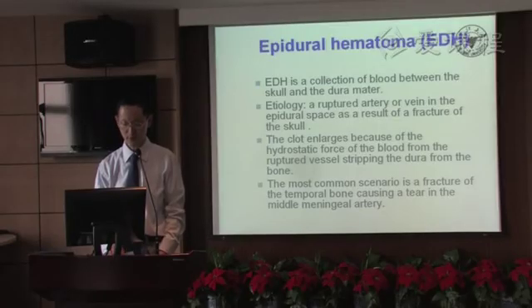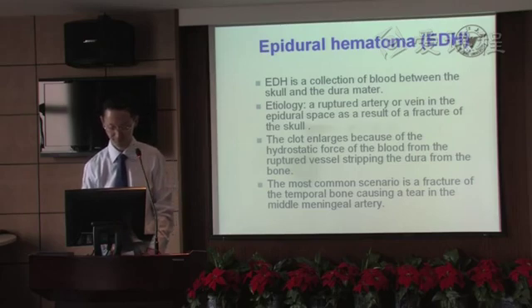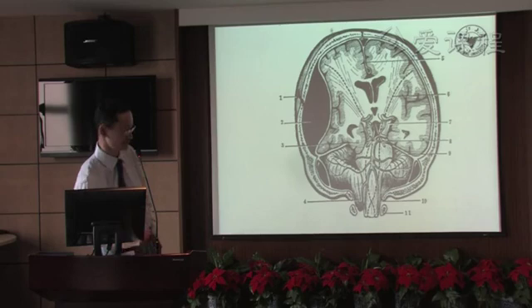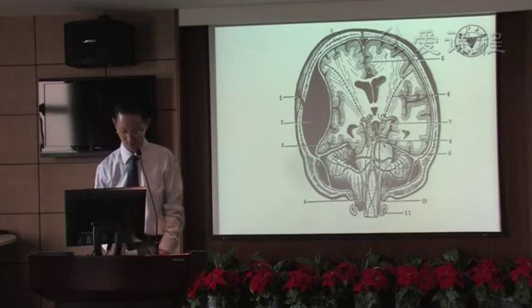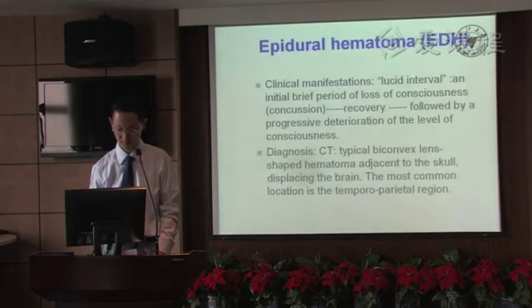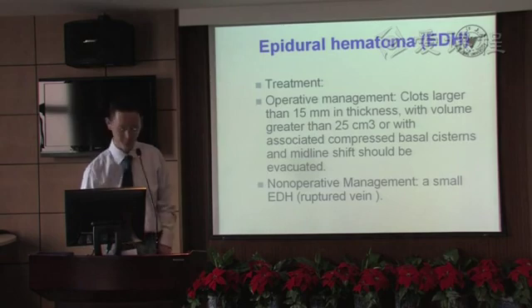Temporoparietal region. The presence of mass effect and midline shift depends on the size of the clot. We can see the epidural hematoma, and this is the skull fracture. We can see the epidural hematoma here. Operative management.